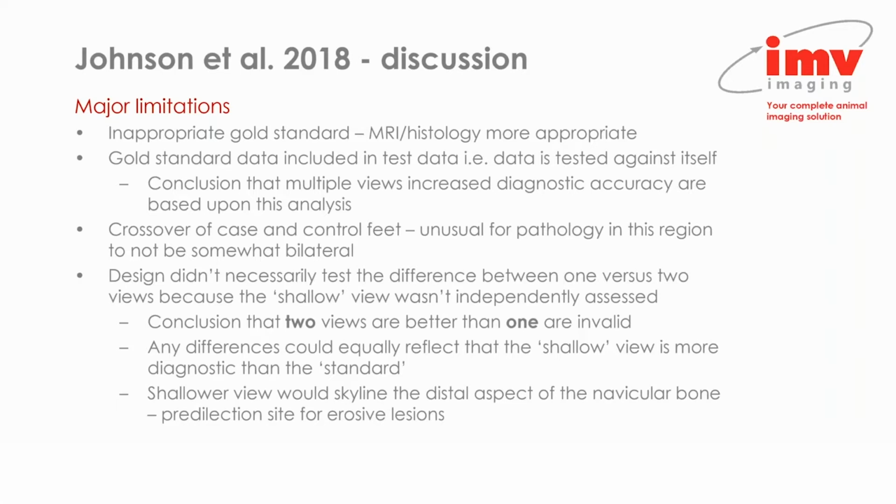Further, the design of the study didn't necessarily test the difference between 1 versus 2 views, and this is what the study aimed to do. This is because the shallow view alone wasn't independently assessed. And so we cannot make any conclusions that 2 views are better than 1 based upon this study, because any differences between 2 versus 1 view could equally reflect the fact that the shallow view may have been more diagnostic than the standard view.